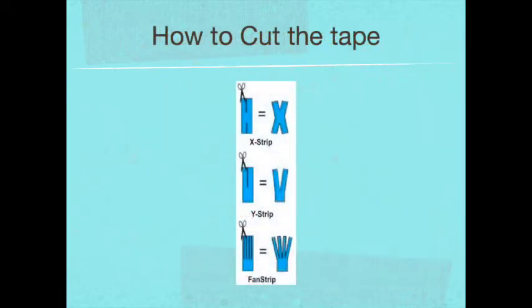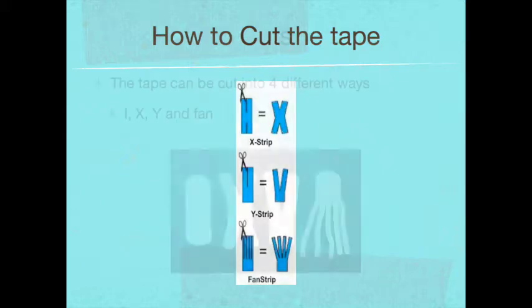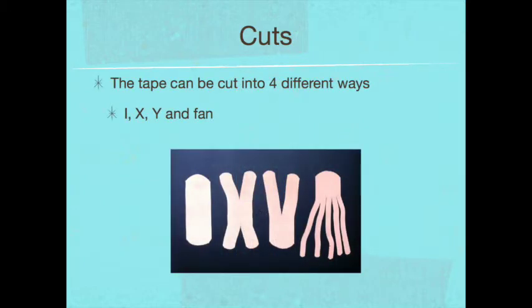There are several ways to cut the tape, which are going to help give us the different effects that we're looking for. The four cuts that we're going to utilize are the I cut, the X cut, the Y cut, and the fan cut, which are pretty self-explanatory. That's what they look like.